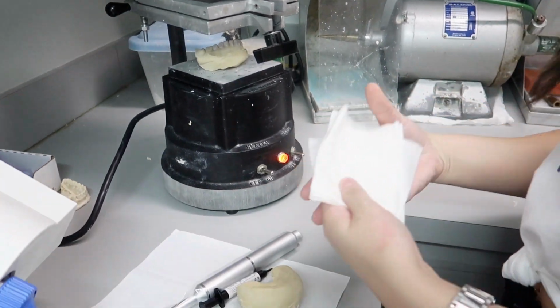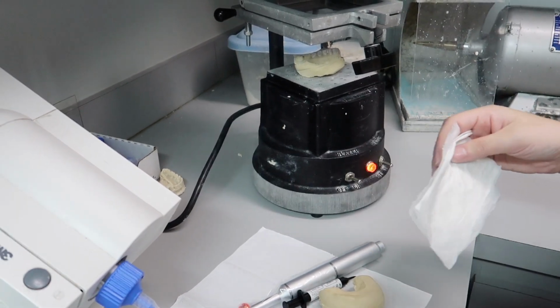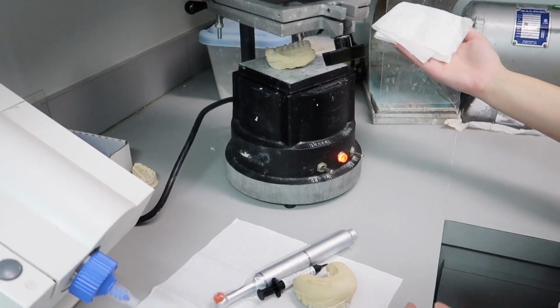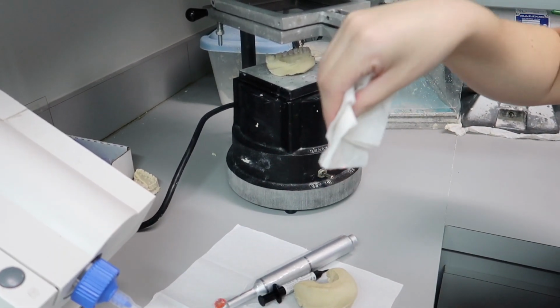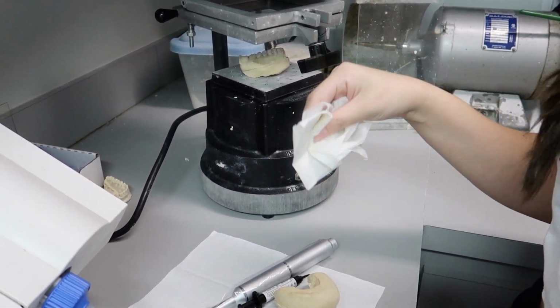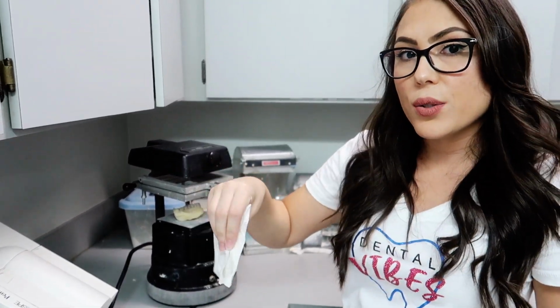I like to have a moist paper towel next to me, because whenever I drop the tray, I'm going to pinch around to make sure that it's tight on the model. The worst thing to have is a bleaching tray that's not tight to your teeth and is falling down when you have it in for 30 minutes. That's super annoying. So you want to make sure your bleaching trays are tight on the model. That's a great idea. I always touch it with my own fingers and burn myself. Yeah, and if it's wet, it doesn't stick to the material.